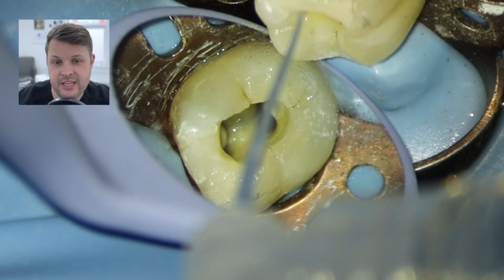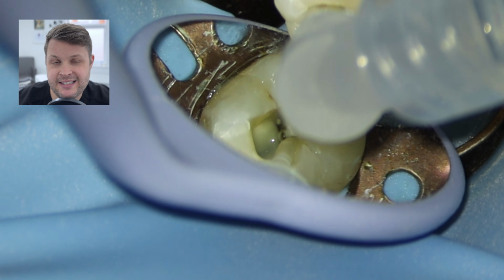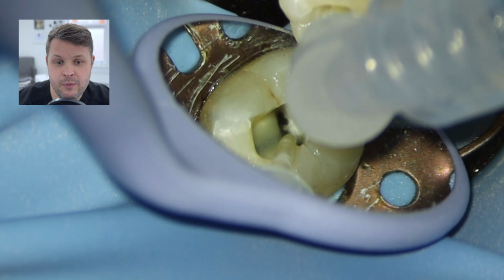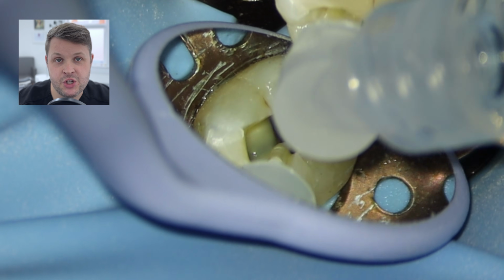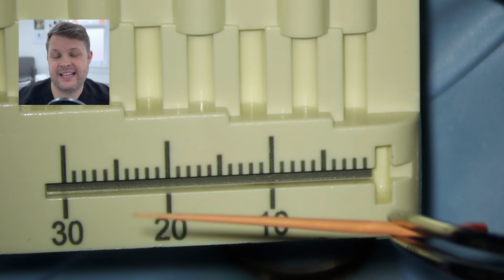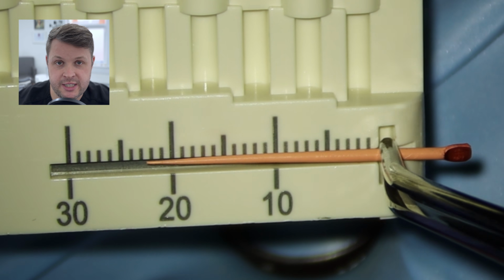So in a way, some people might say that this is a ribbon-shaped canal, or that these are 2 different orifices. It's irrelevant really, but you can see here when we aspirate and irrigate the canal, both of these 2 orifices are irrigating and aspirating together. So what I want to work out is at which point these 2 orifices join together.